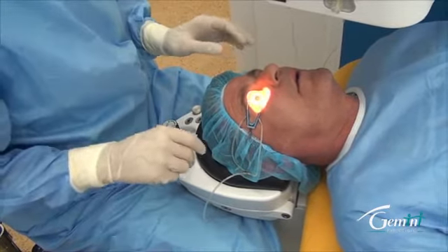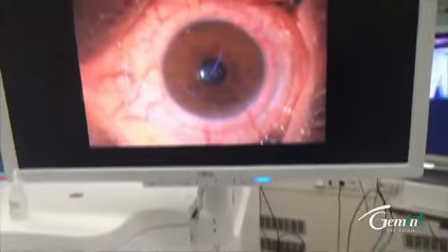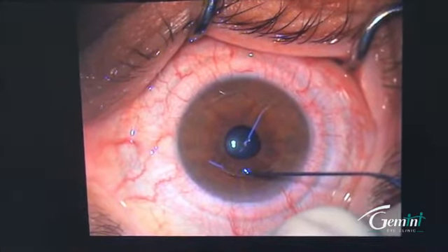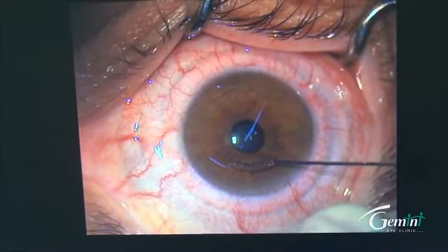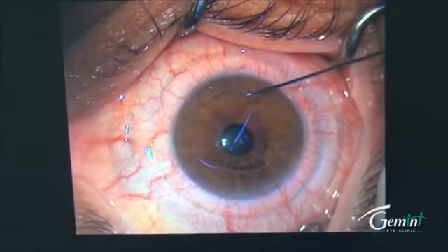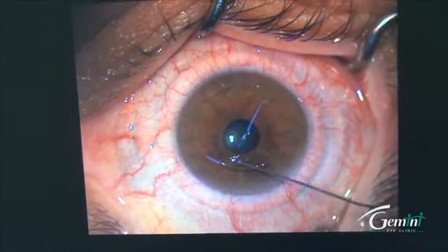Okay. And the next step is opening the incision. So you see this at higher magnification at the screen, and the incisions are just self-opening. You see how easy it is to open them? We just look at them and they are open. All perfect. Wonderful. Just exact shape, everything.